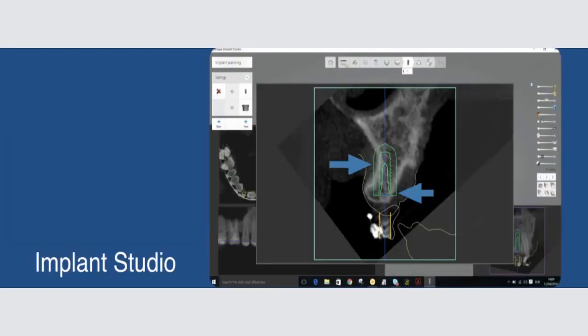In this particular case, as you all can appreciate for people doing implants, as you can see, to improve the positioning of the implant, it would happen a fenestration. I would have a fenestration on the buccal aspect of the implant. I could make the implant longer. I could really go a little more than that.